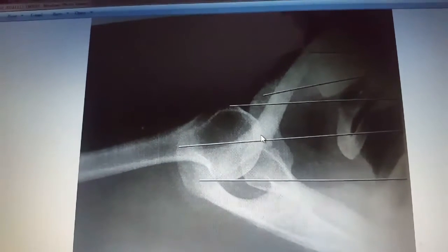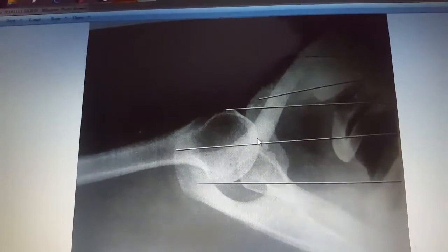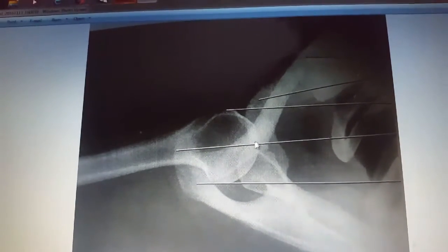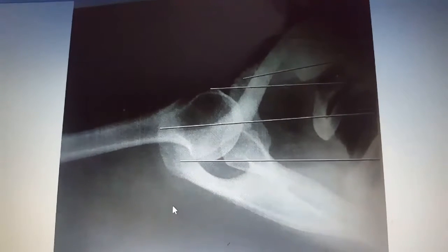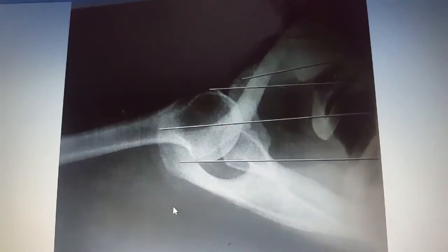And finally, just checking for soft tissue in the axilla with bony trabecular detail. So that could be seen in general and within the image. And this concludes the evaluation criteria for the 4 projections that were done of the shoulder.